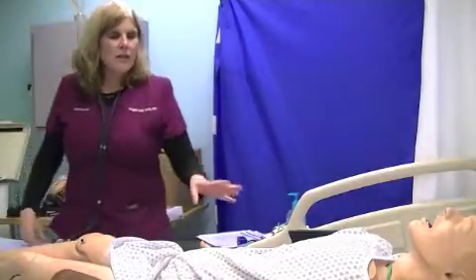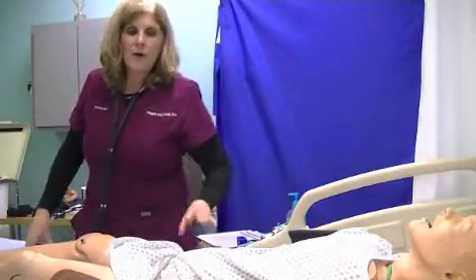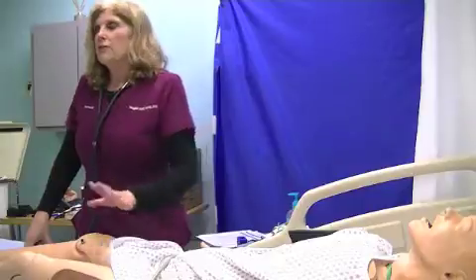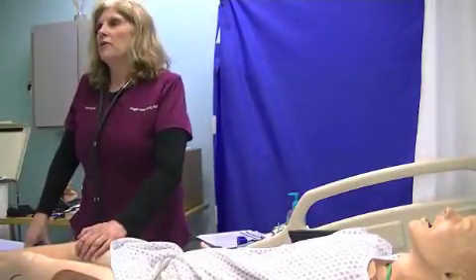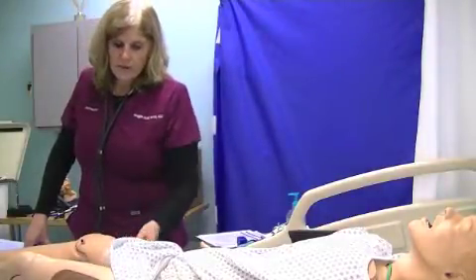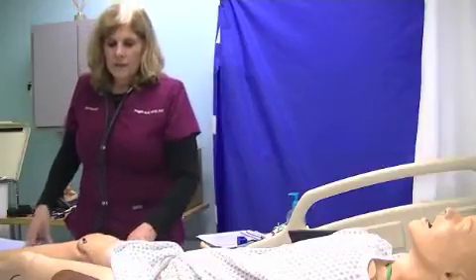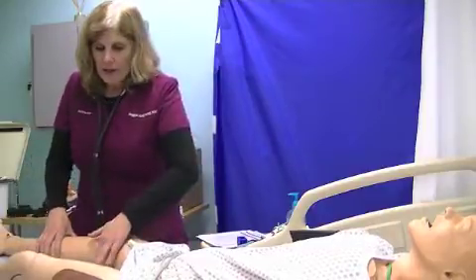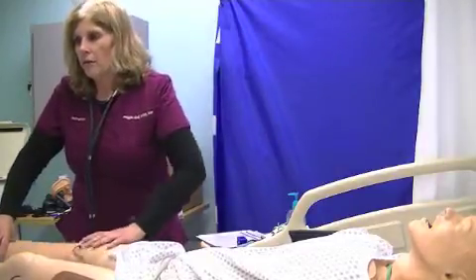If you had a patient, like I had a patient one time when I first started nursing, that had mastectomy in both arms, then you have to go to the leg. So we have a thigh cuff, and there's an alternative way for the thigh cuff. You can put it around the top part of the leg, and you can listen at the popliteal artery. So that works with the thigh cuff.